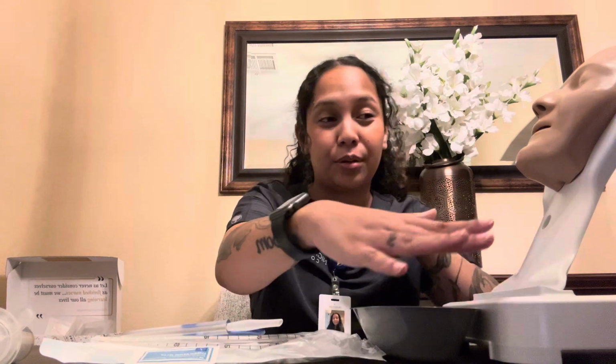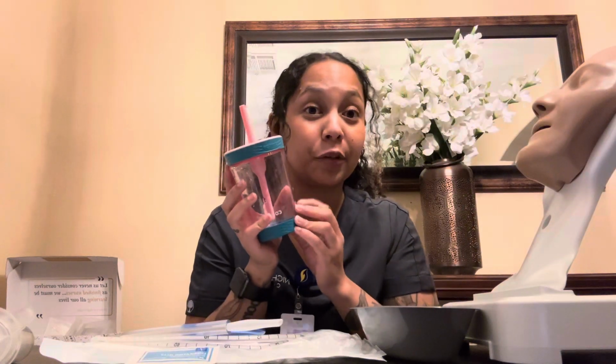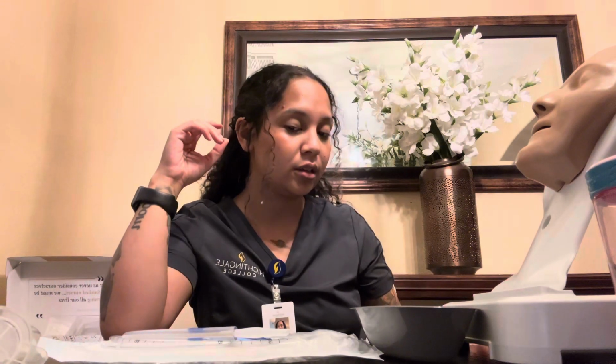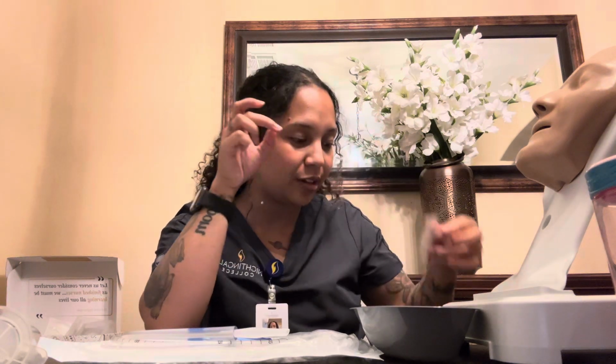In front of me, I have my little wash bin in case Tina throws up or gags a little bit or any spit up. Let's say I have a towel as well, I would put that here. Here's my cup for her to drink while I'm doing the procedure. Here I have my NG tube, and right now I am having it warmed up in some water so it's more malleable. I have some lubricating jelly. I have my piston syringe. I have my tape here in the little pants formation that the evaluator said in the video. And then this is my pen light.